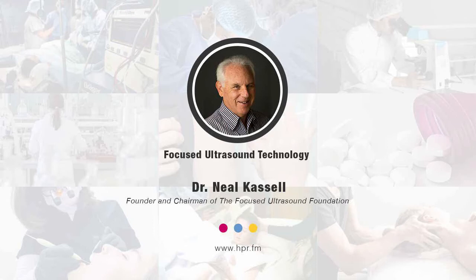It is amazing. And the point in the body where the beams are focused, the target, is selected and monitored and guided and controlled by real-time imaging, either magnetic resonance imaging or ultrasound imaging. So you can actually watch the effect that the focused ultrasound is having on the tissue in real time as the treatment is being administered, in contrast to radiation therapy, where the effects are invisible while radiation is being administered and where it takes weeks or months for radiation to have an effect. The effect of ultrasound is immediate and verifiable.